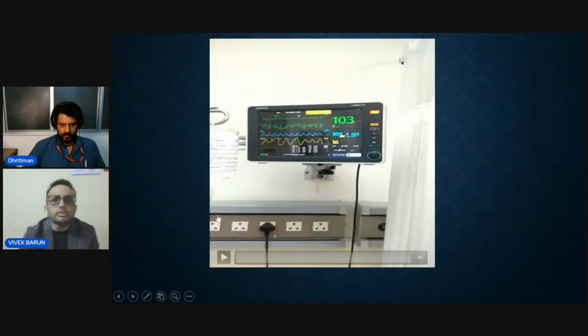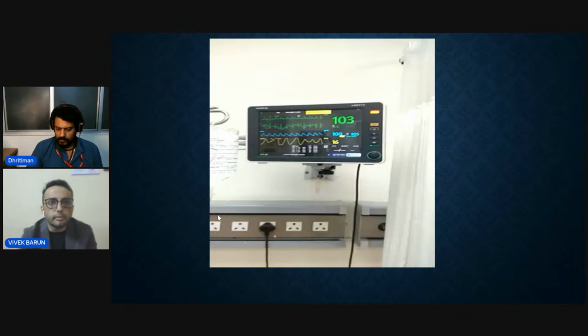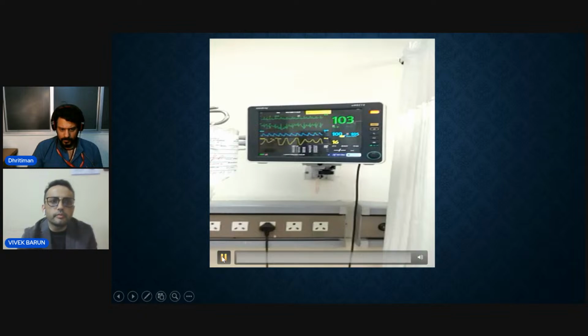And this is one video. First we gave her midazolam infusion, then we gave levetiracetam, but she was unable to comprehend. Then after giving lacosamide, we took one video.